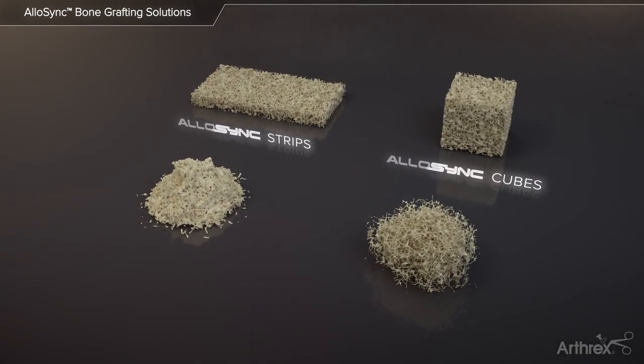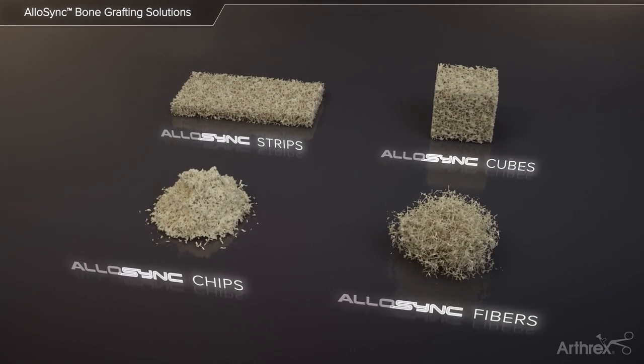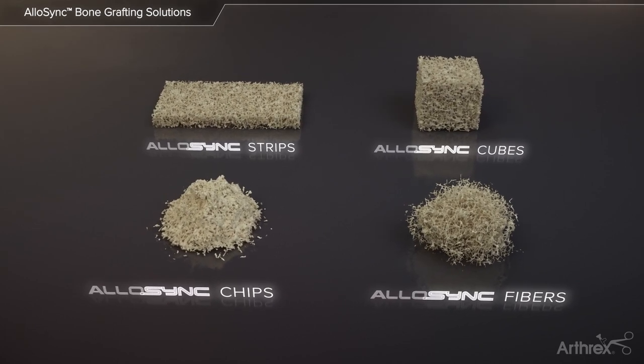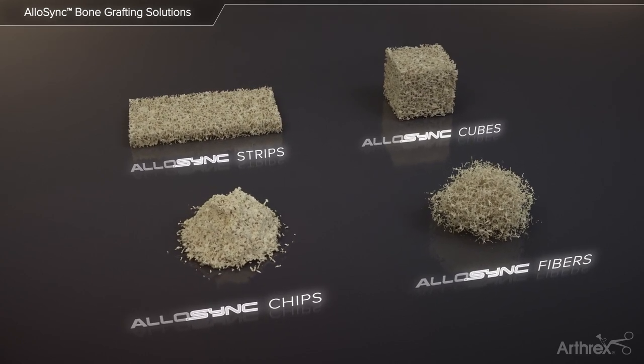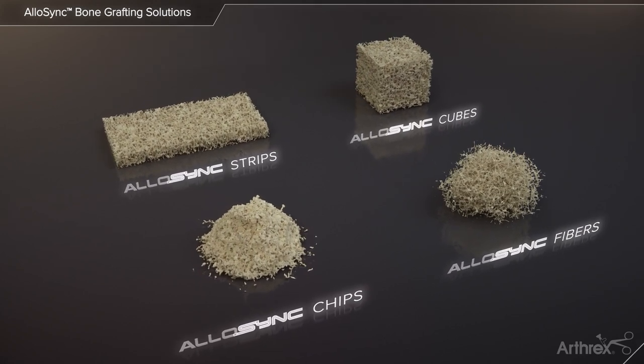Allosync demineralized sponges and fibers are available in a variety of shapes and sizes including cancellous strips, cubes, chips, and cortical fibers. These grafts maintain the natural bone architecture with interconnected porosity, providing an optimal scaffold for cellular attachment and proliferation while preserving native bone morphogenic proteins.